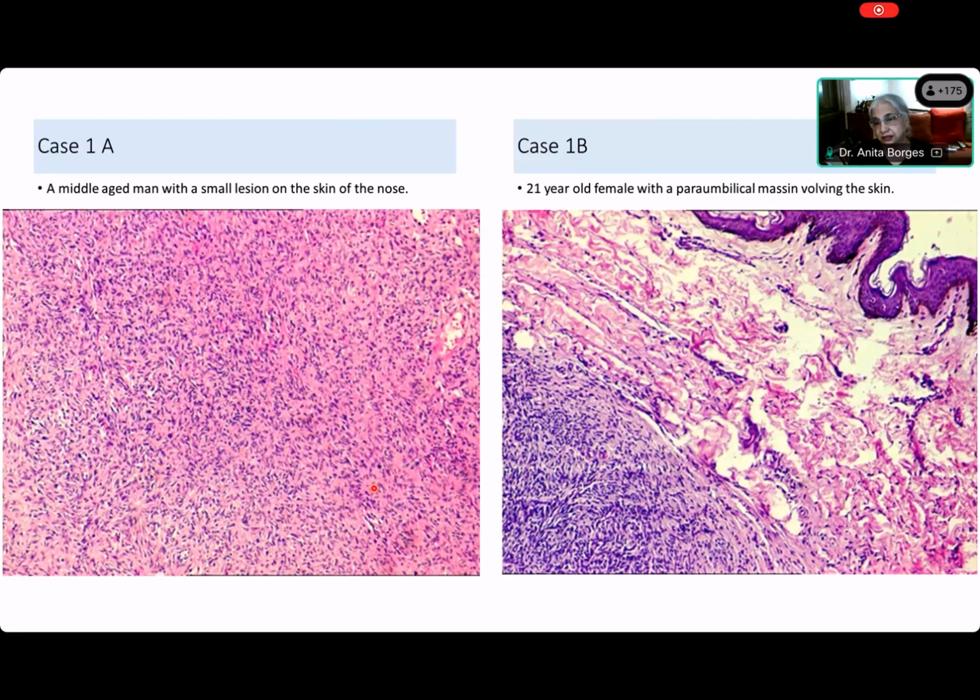Is it a fascicle now? Saida, you don't want me to do this, right? You don't want to be spoon-fed. So what are the patterns that we discussed? Come on. Ma'am, fascicles, herringbone, storiform, palisade, plexiform. Yes. And hemangiopericytomatous is plexiform. And we have sheets, right? Yes.